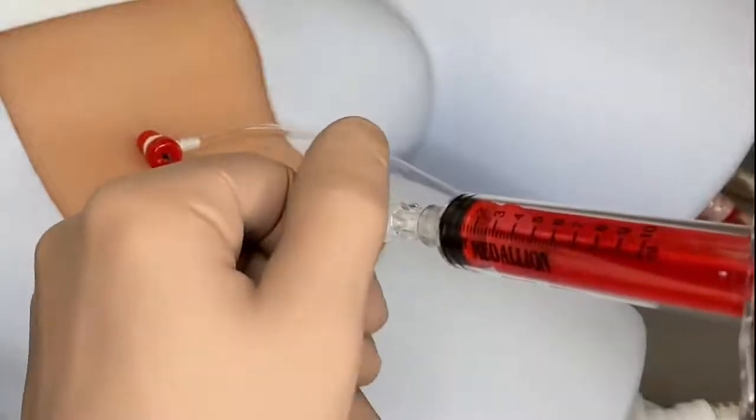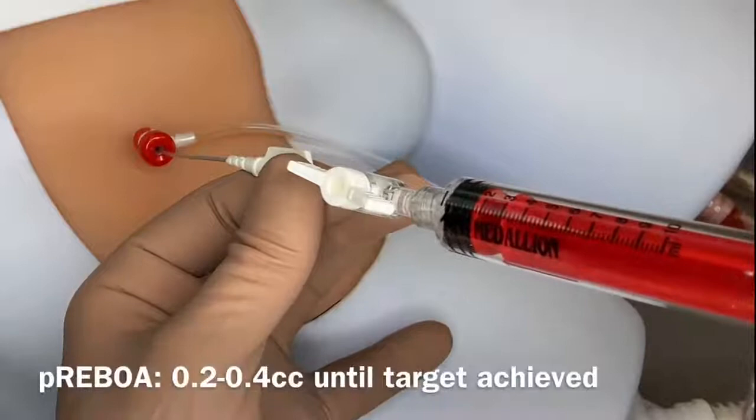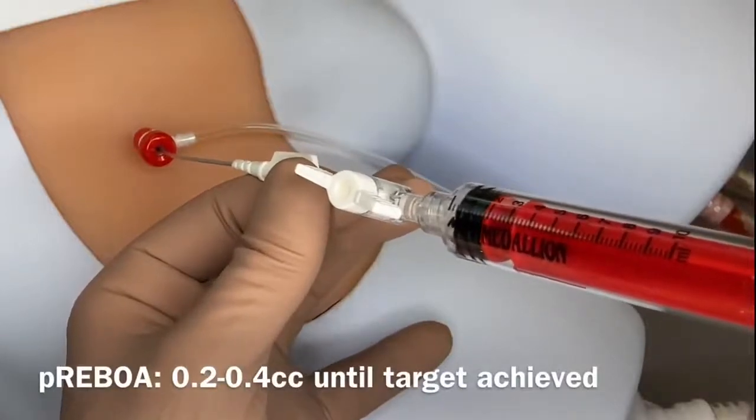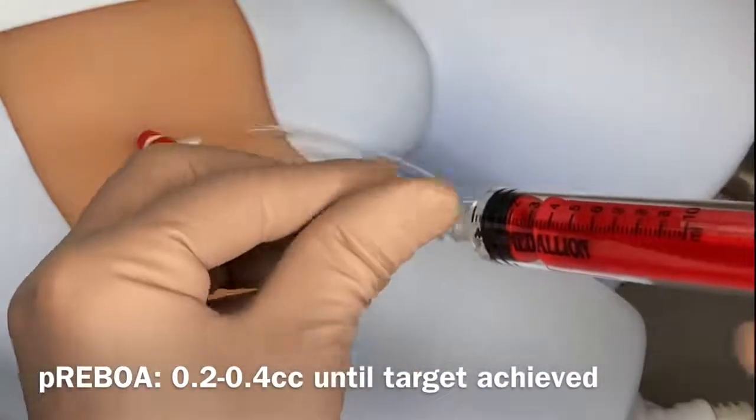To deflate the balloon, open the stopcock and draw back on the syringe. To deflate the balloon slowly or for partial REBOA purposes, remove 0.2 to 0.4 cc at a time, closing the stopcock each time.